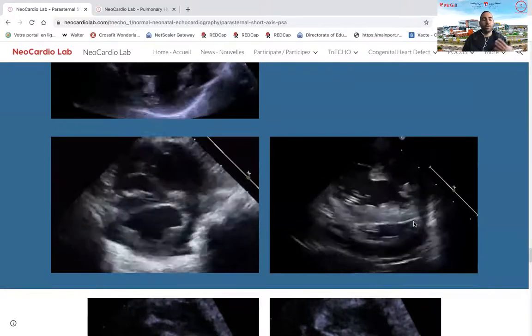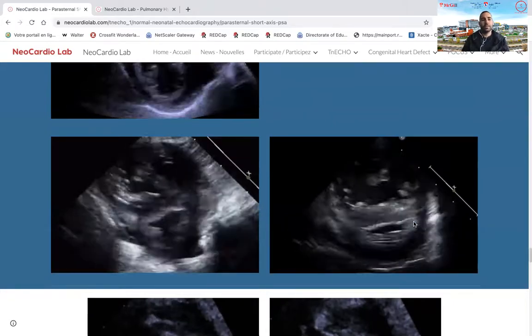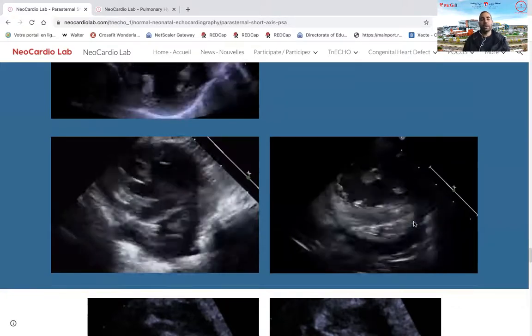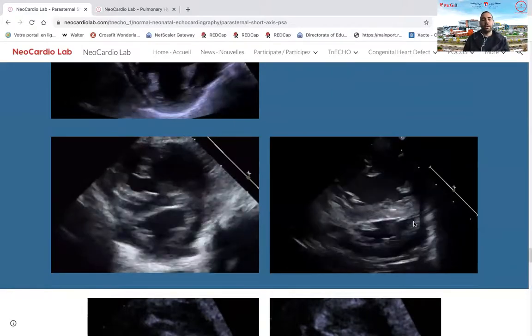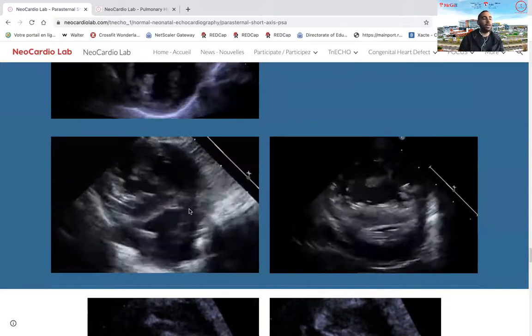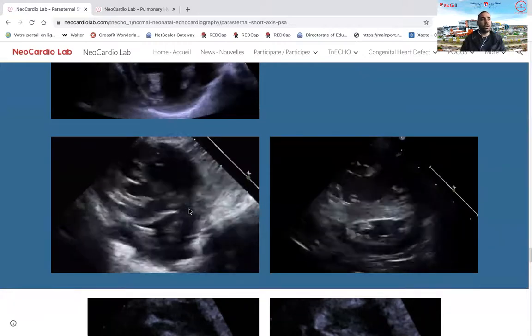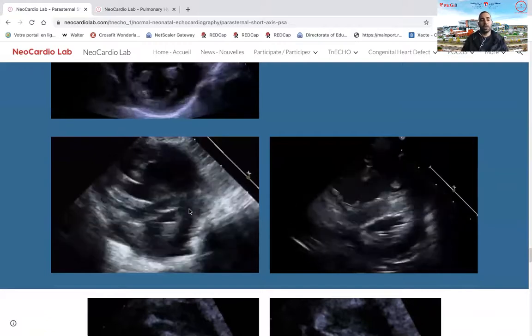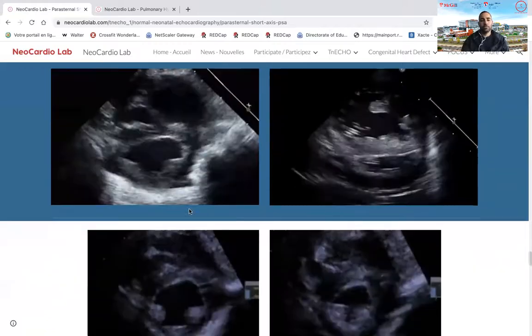And so patients who have progressive systolic dysfunction of their right ventricle and increased afterload will eventually have an impact on the capacity to empty the ventricle, and will end up with increased right ventricular end-diastolic pressure, which might end up causing some septal flattening even in diastole. Typically, we would see isolated septal flattening in diastole in patients who have long-standing left to right shunting via an ASD, causing a lot of loading, a preload increase in the right ventricle.